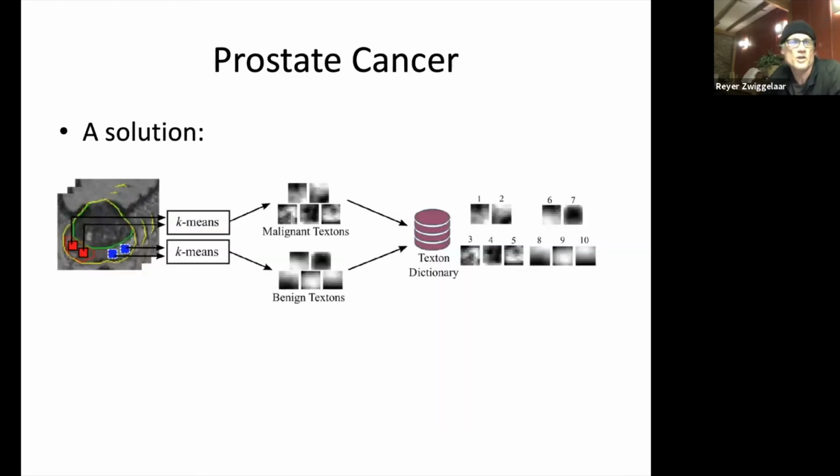So we said we wanted to know what's happening in the peripheral zone and in the central zone, and if those are abnormalities or not. And we've got a set of different tools for that that we've explored over the last couple of years. The first of those is something that's really simple, and it's a Texton-based approach, which we just borrowed from some texture analysis people that have developed that in the past.